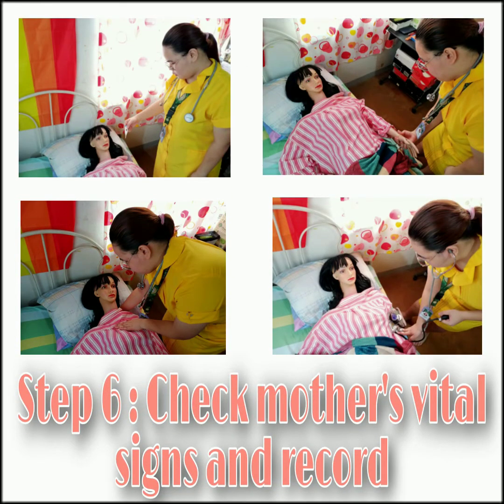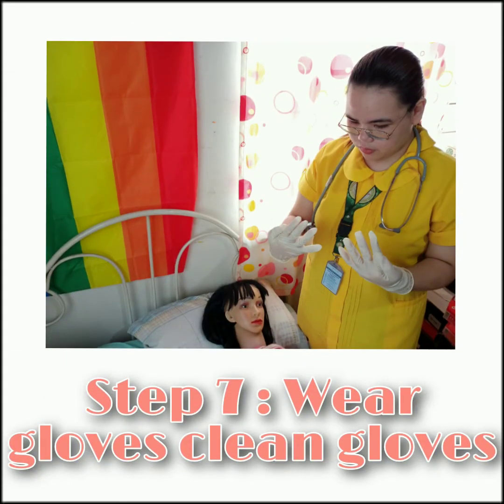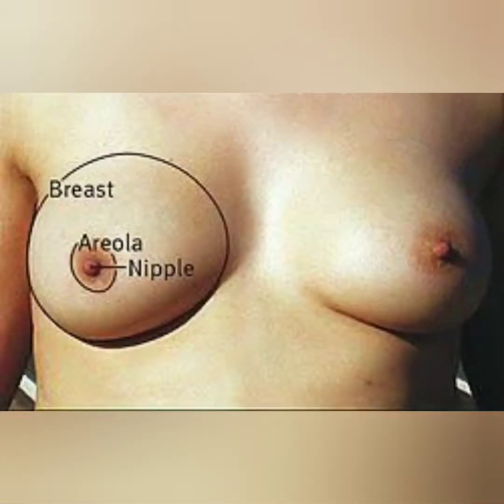Step 6. Check mother's vital signs and records, including blood pressure, respiratory rate, temperature, and pulse rate. Step 7. Wear clean gloves. So first, we are going to have breast assessment.